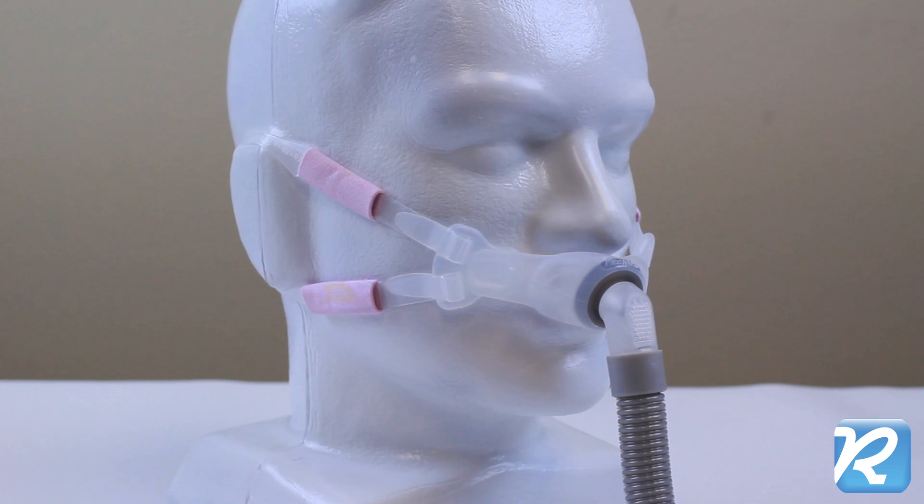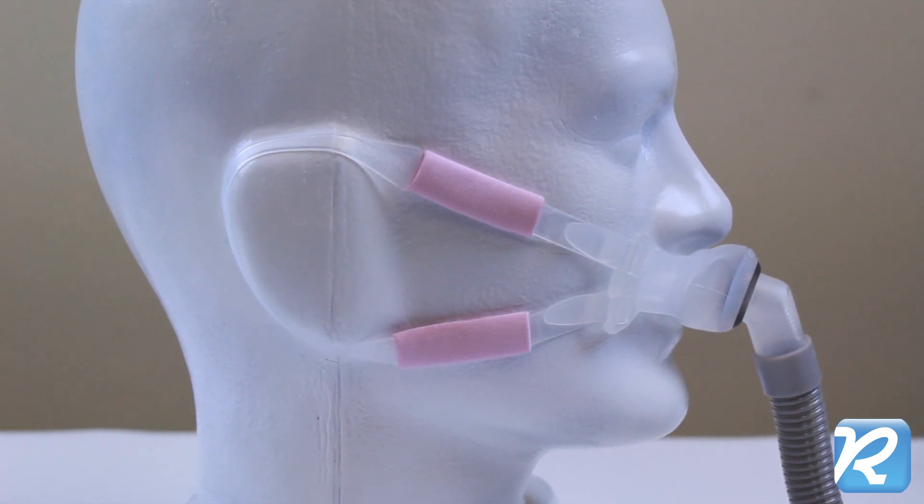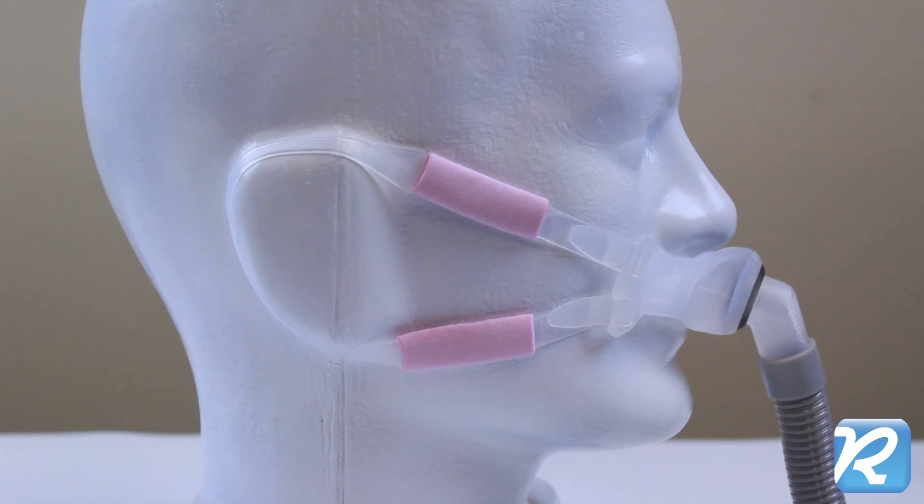ResMed's SwiftFX Bella, for her, is a lightweight, innovative nasal pillow mask for CPAP that offers the option of using ear loops instead of headgear.